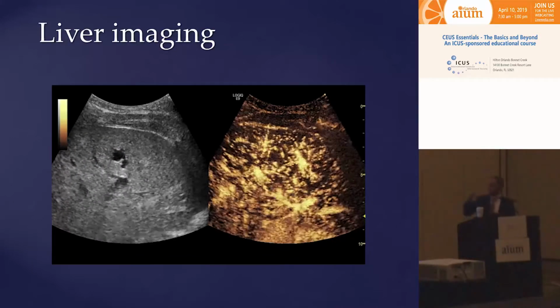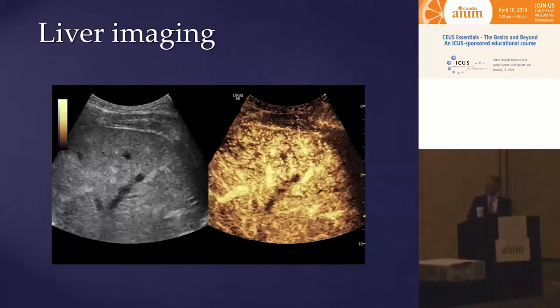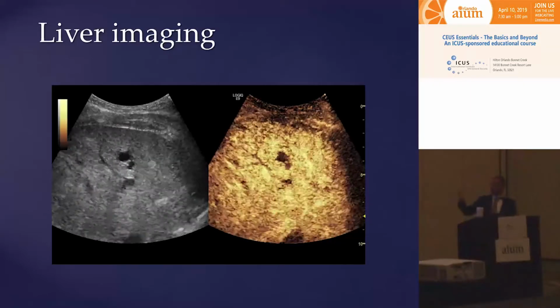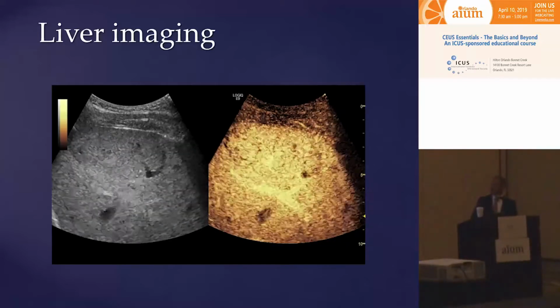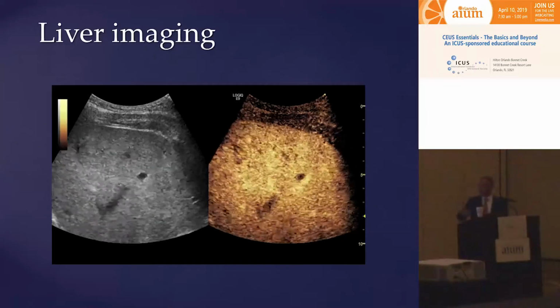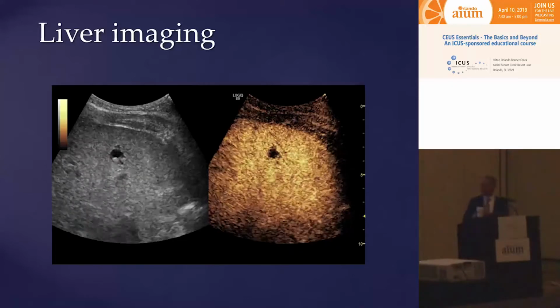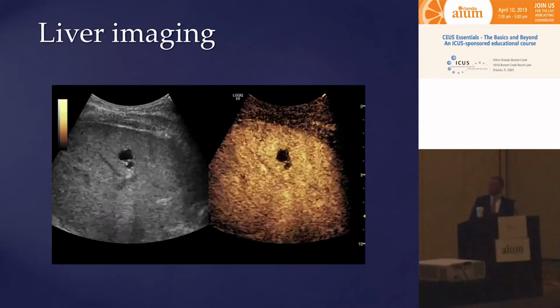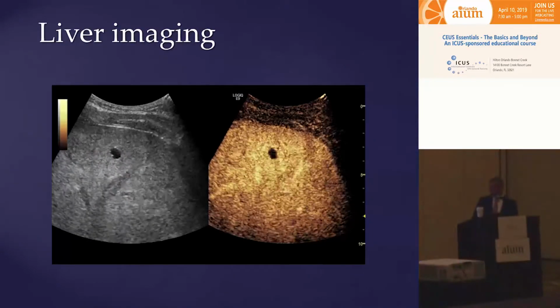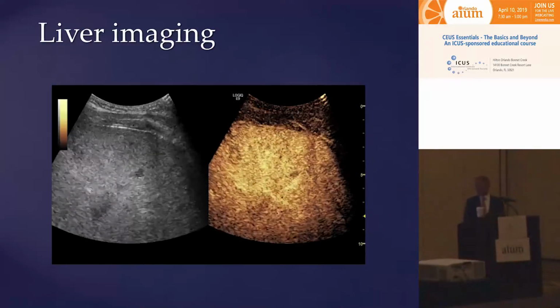You see nicely enhancing hepatic arteries, portal veins enhance after that, leaving hepatic veins relatively unenhanced, and then slowly you're going to see contrast enhancement in the hepatic veins, filling the entire liver with contrast, leaving this small tiny cyst that I included in this image for reference unenhanced.